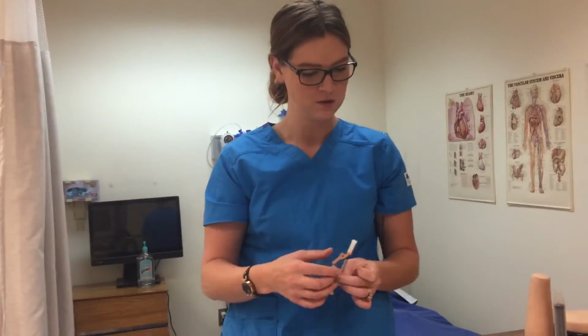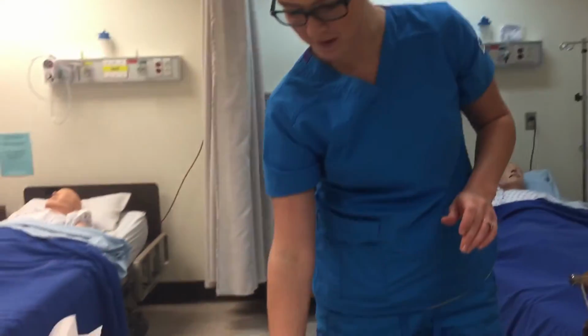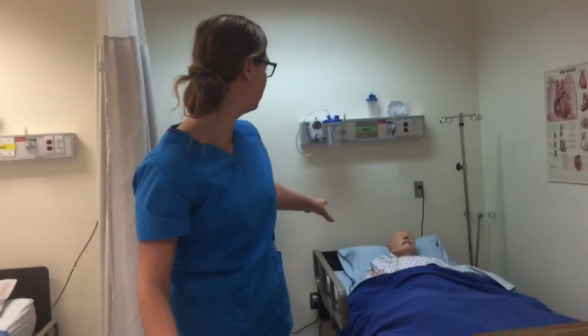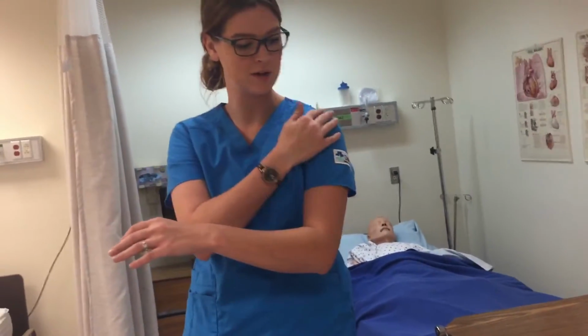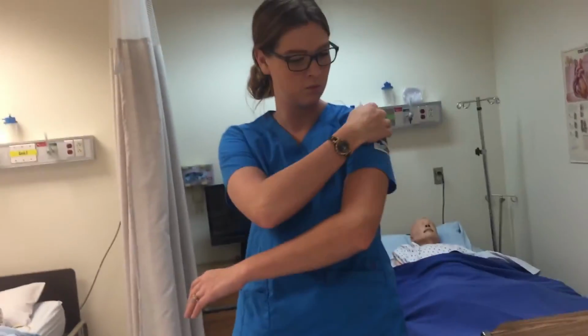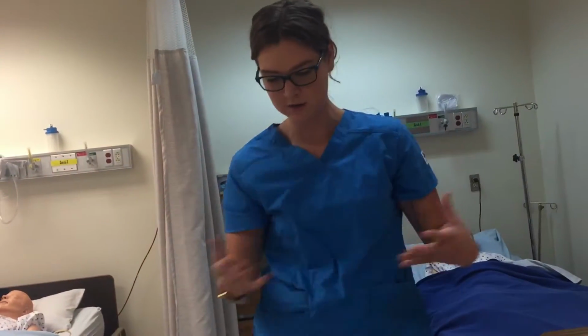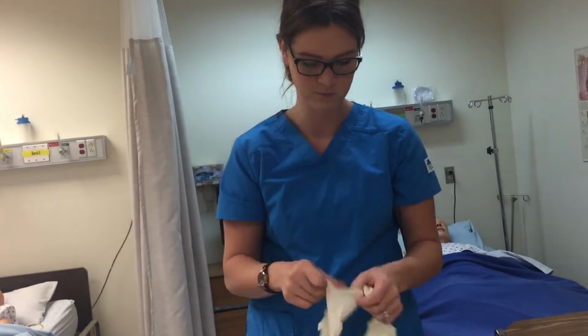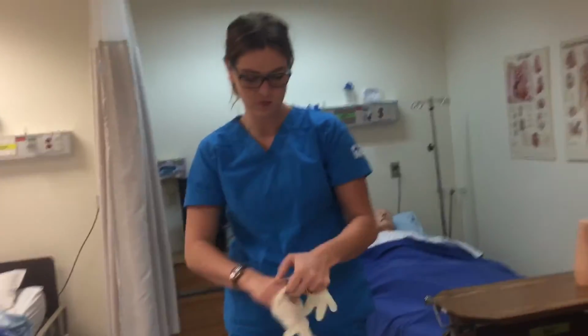Okay. So at this time, I would go and look at my patient, and I would take these with me. I'd look for her acromion process, I would note where I'm going to inject the medication, I would say, okay, little poke, and then I would, which I will show. So I'm going to put on gloves.